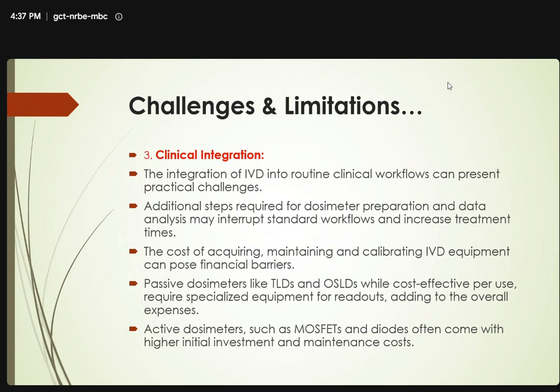Now, third is the clinical integration. The integration of in vivo dosimetry into routine clinical workflows can present practical challenges also. Additional steps required for dosimeter preparation and data analysis may interrupt the standard workflows and increase treatment time.